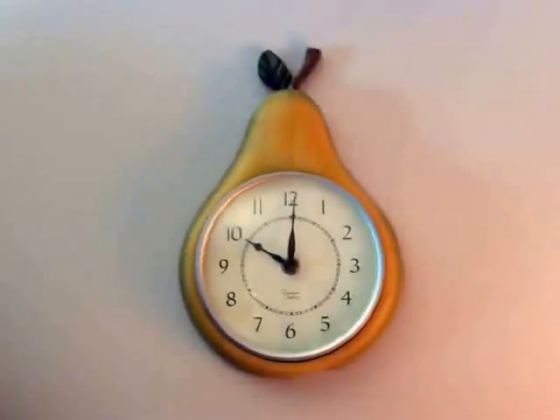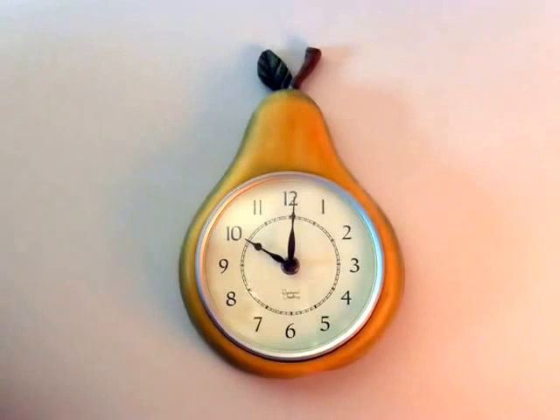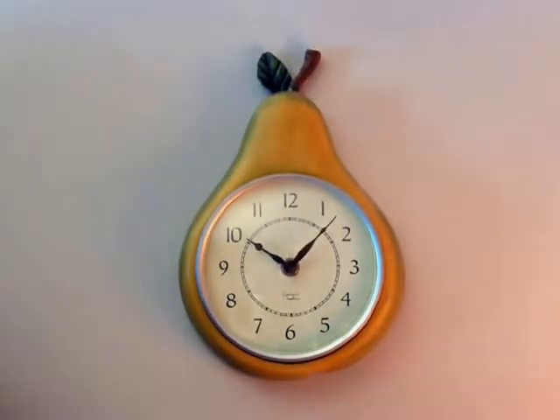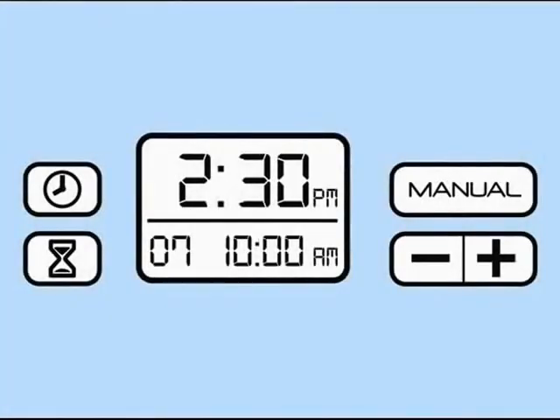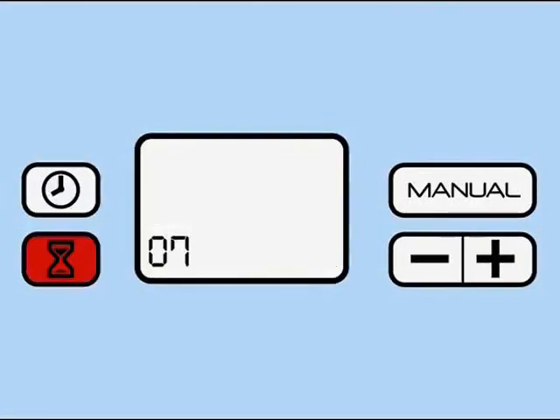The soak clean comes preset to start a 7 minute cycle at 10 o'clock AM every day. If you wish to change these settings, it's easy. You can do this by pushing the hourglass button.